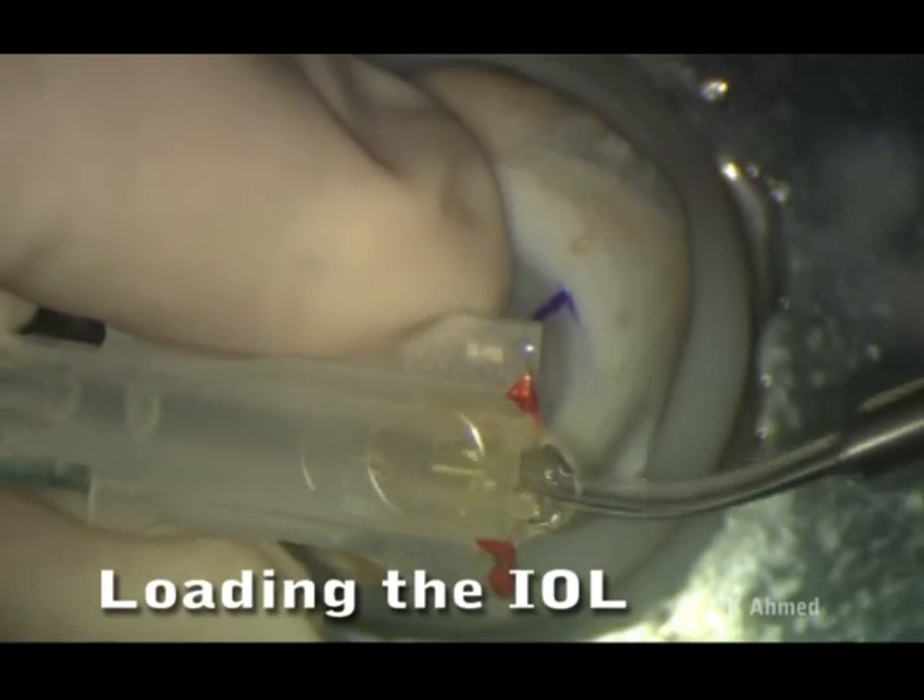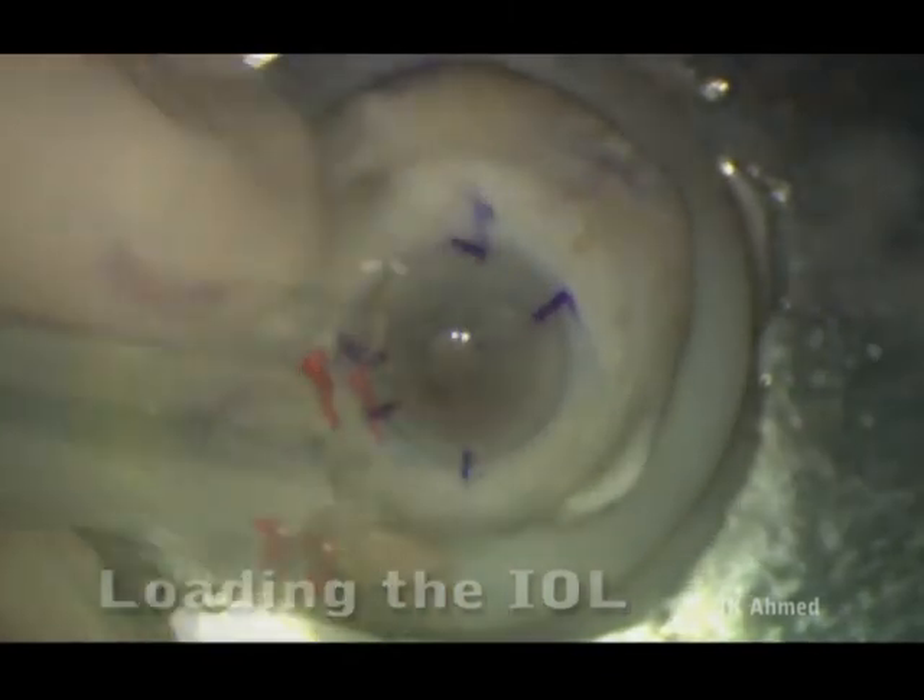Typically, during surgery, one would implant the toric lens in the bag and rotate the lens such that the toric marks align with the pre-marked axis of astigmatism. Let's take a look.